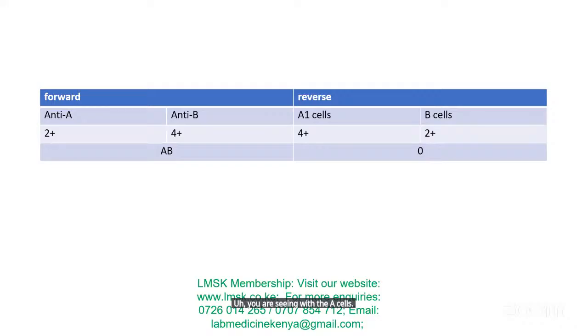I mean, with the anti-A in the forward typing, and then on the reverse, it is also very consistent with the B cells. So you have to rule that out. It could be autoantibodies or alloantibodies that are reacting weakly with these particular cells.